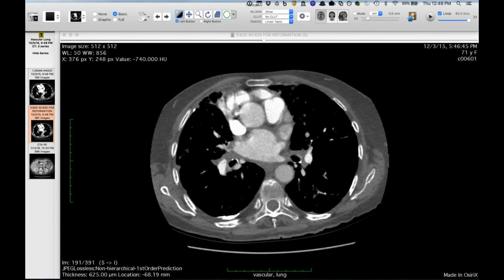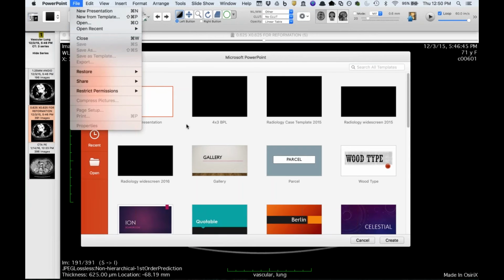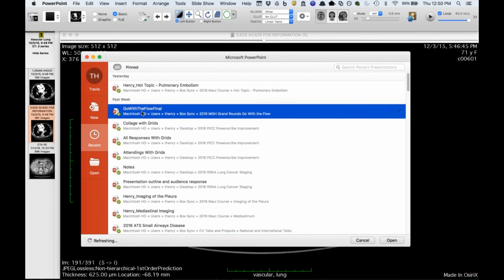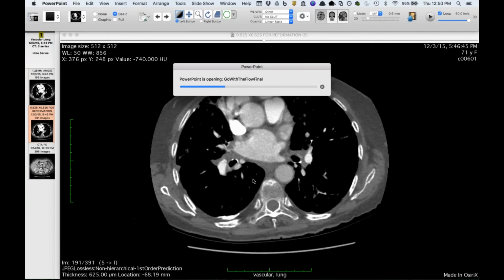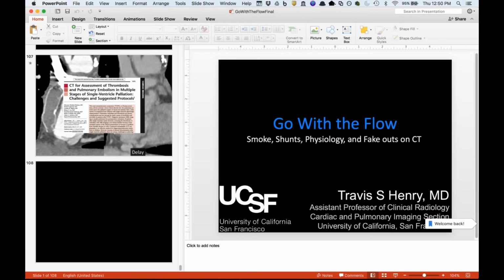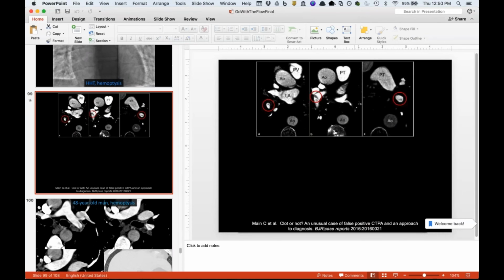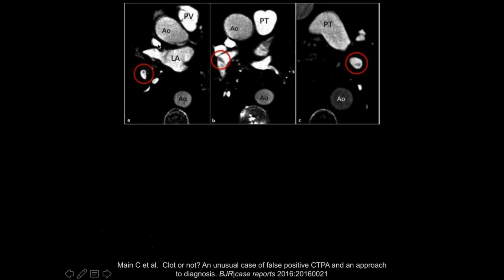As one of the contributions? Let me pull up my PowerPoint really quick. I'll show you, because I know we've talked about bronchial artery inflow as a cause of one of these, and in the setting of bronchiectasis. This is a case report, and here you can see this is a very good example, very similar to this case I just showed you. Not a lot of flow downstream, and you can see these filling defects.